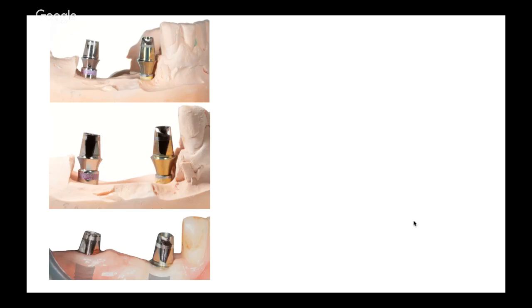Please imagine that the implant has a tetragonal structure. If there is a fault, the line we drew would have a distortion, maybe a 90-degree distortion. When the line is on the buccal side in the model, in the mouth it will be on the mesial or distal side. You can recognize it very easily.